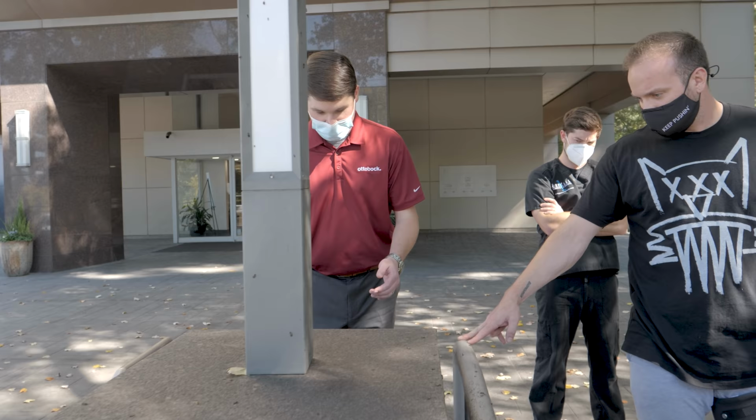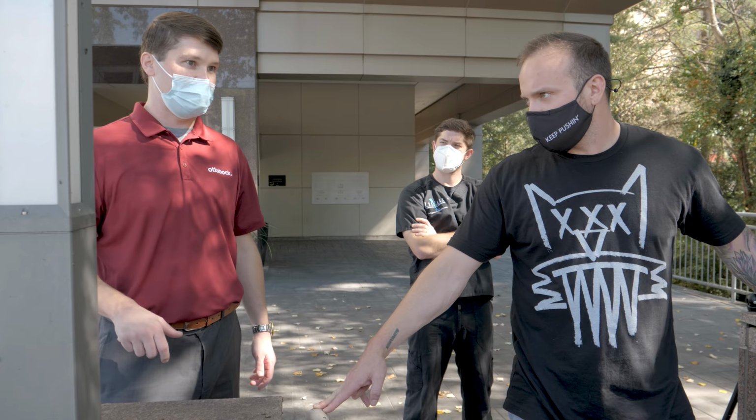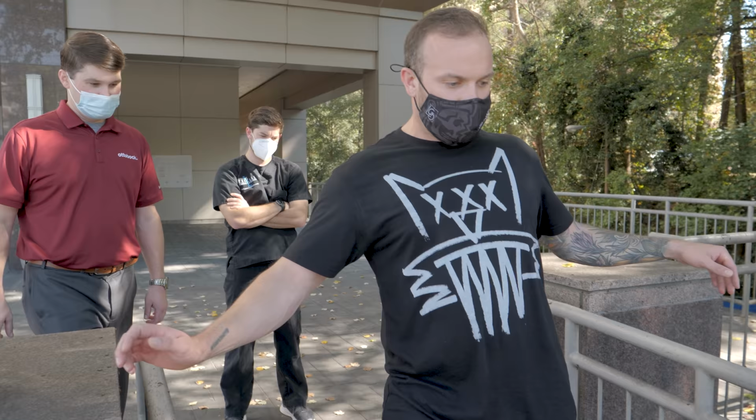So I'm not going to release this joint. Whatever you set that resistance, which is what, 185? So you're at 185 when you're stepping, so it's going to feel like you're bending a really thick rubber band. This part's fine. It's clear in the toe. Good, not good. So it has to release.